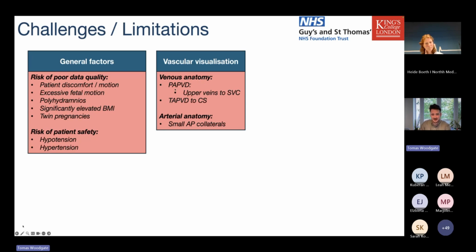But if you've got the right upper vein to the SVC, that can be tricky if it's low down. It can look essentially normal, or you can overcall it because there's lots of structures on your black blood imaging behind the atrial mass. So you'll have pulmonary arteries and their branches, systemic veins and their branches, and airway branches, which can all be easily mistaken for veins on your black blood imaging. So, a bit of caution about the PAPVD of the upper veins.